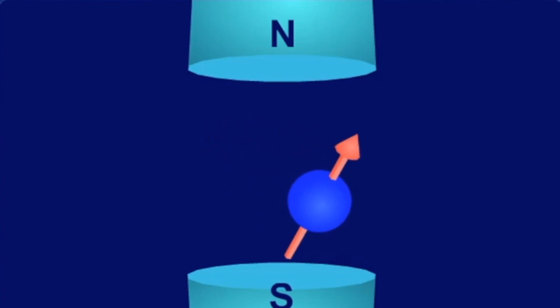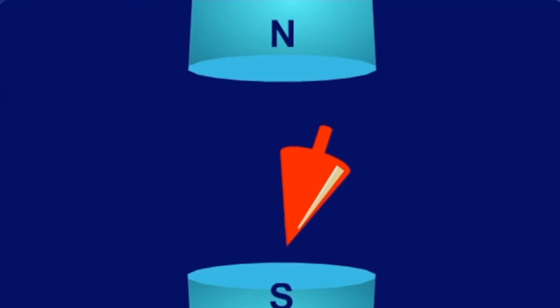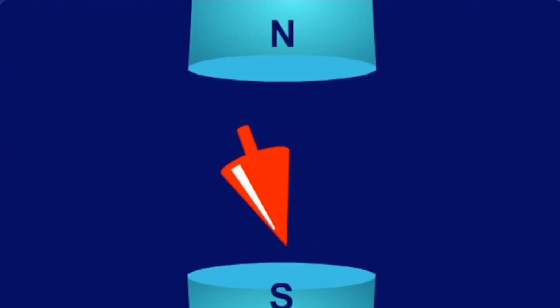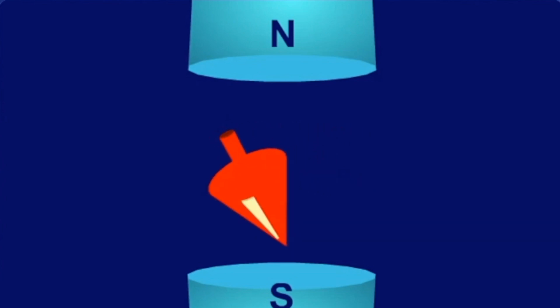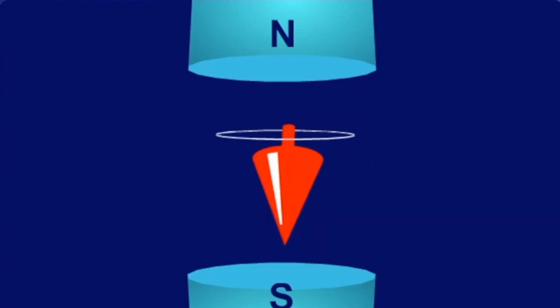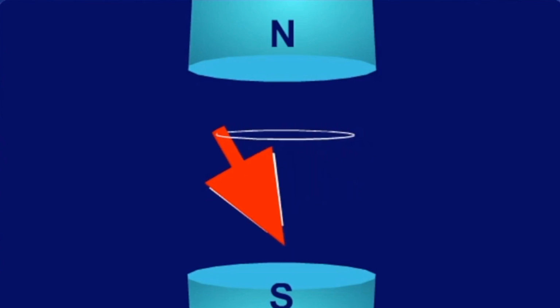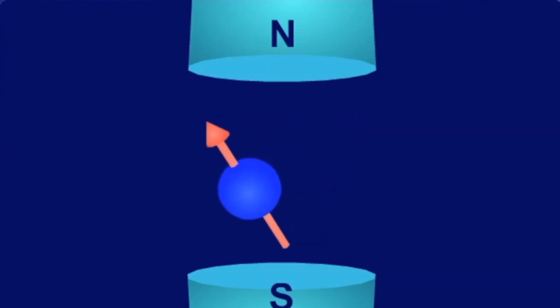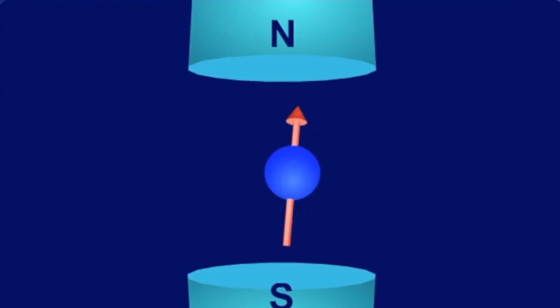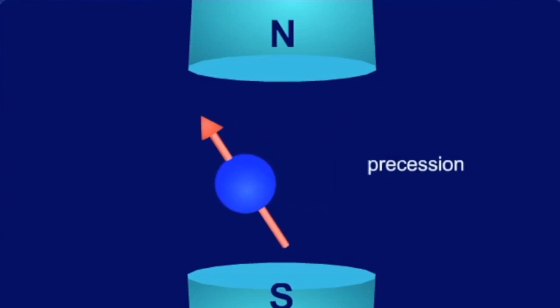What type of movement is precession? Just imagine a spinning top. When you hit it, it starts to wobble or tumble around. It doesn't, however, fall over. During the precession, the axis of the spinning top circles, forming a cone shape. Protons, in a strong magnetic field, also show this wobbling type of motion, which is called precession.